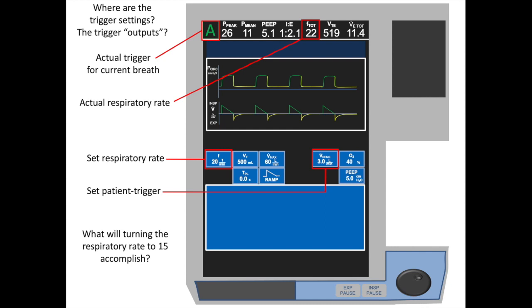So the point is that if you go to the bedside and you see just C, that is, breath after breath is triggered by the ventilator, either that patient is paralyzed and you want them to be paralyzed, so they shouldn't be triggering, or you're over-breathing them and making them hypocapnic and going way beyond their neural respiratory drive so that they're not using their diaphragm at all, and you're at risk of atrophying their diaphragm, and then it's going to be harder to get them off the ventilator.